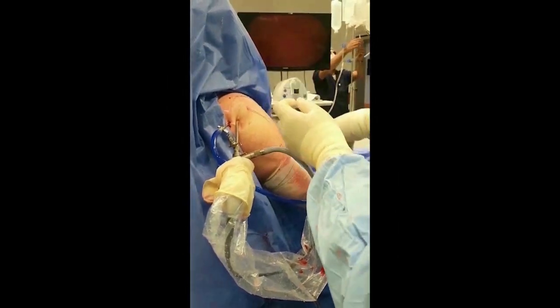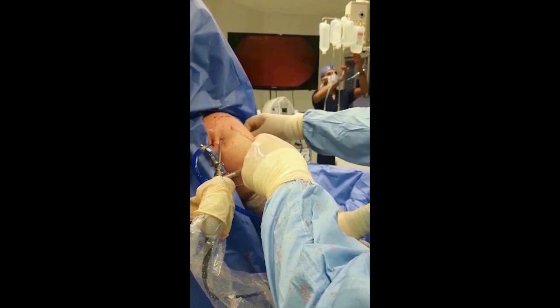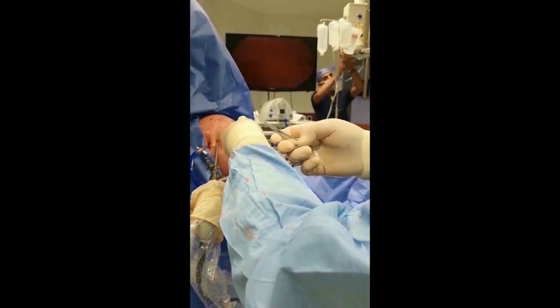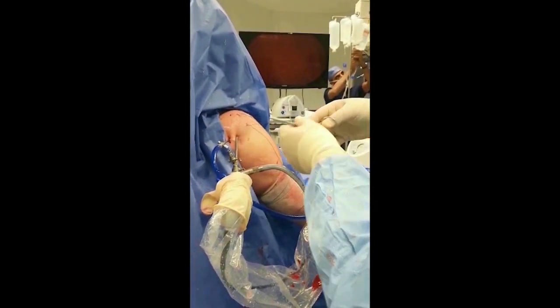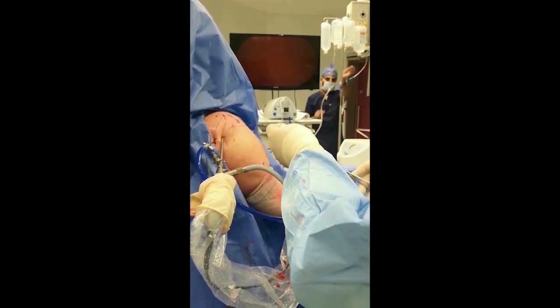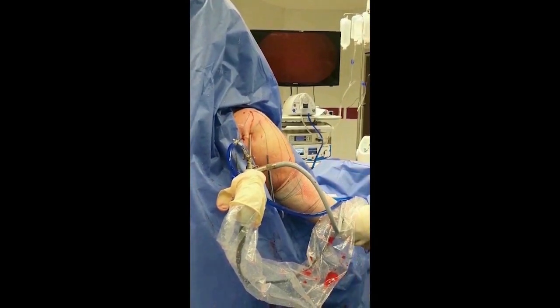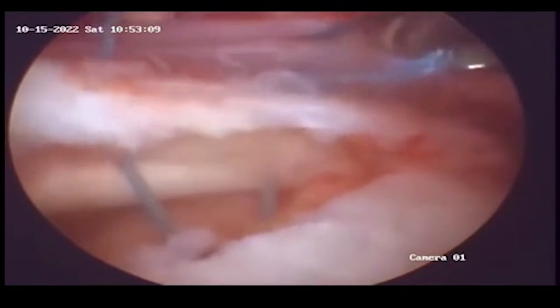The lower ends of the sutures are held with a clamp, and the anterior suture upper end will be pulled out through the instrumentation portal. Here we go with the ring forceps through the portal and pull the suture immediately before it enters the rotator cuff.